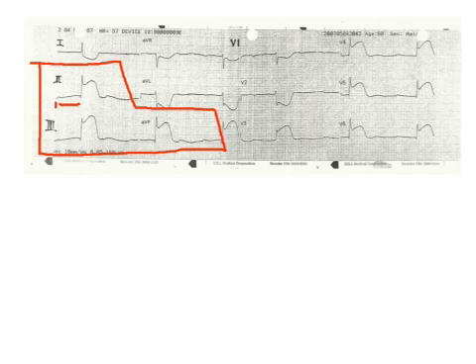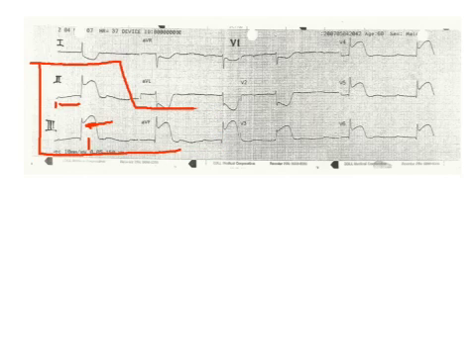We expect bradycardia with an inferior wall MI because the SA and AV nodes take a hit there, so that is not unexpected. What else can we see? We can certainly appreciate what's known as ST elevation. If you look at where the J-point should come back to the baseline, it's clearly not, and you can see the T-wave has merged into the QRS complex. There is significant ST elevation, so it is very safe to say this person is definitely having a STEMI of the inferior wall.